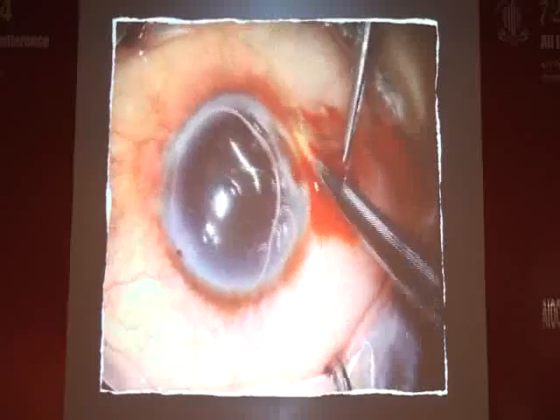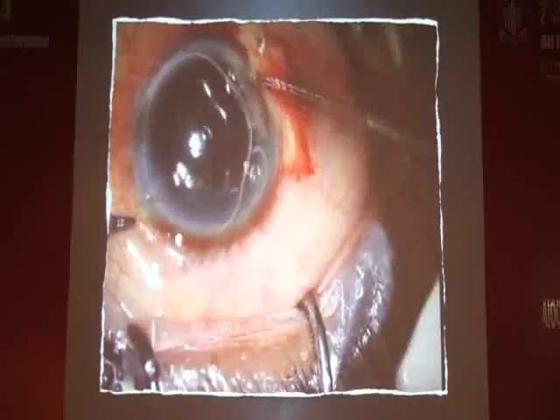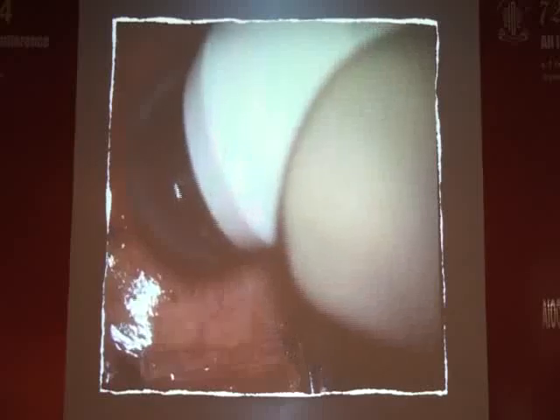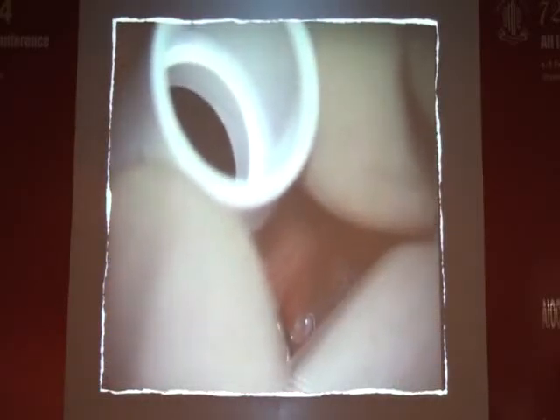It's right in the periphery, so we're going to have to pass some sutures out at the limbus, and therefore it's always nice to do a peritomy there. Smooth that area out, and then again we're using trephines. Any handled trephine is fine. Here it's about 9.5, I think. You can use the same trephine, if you will, for the inner curve as well.